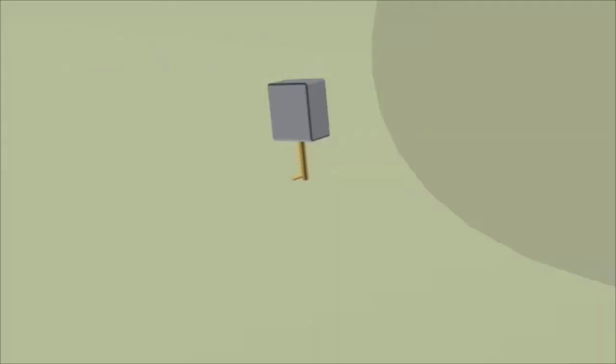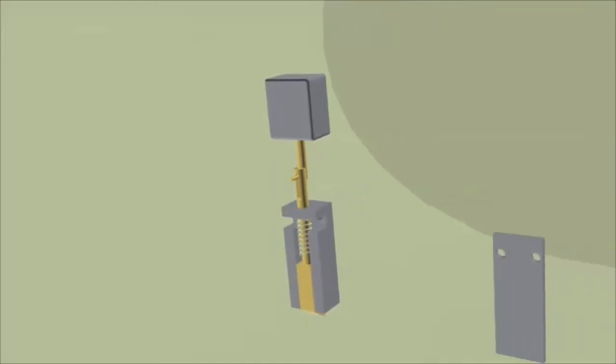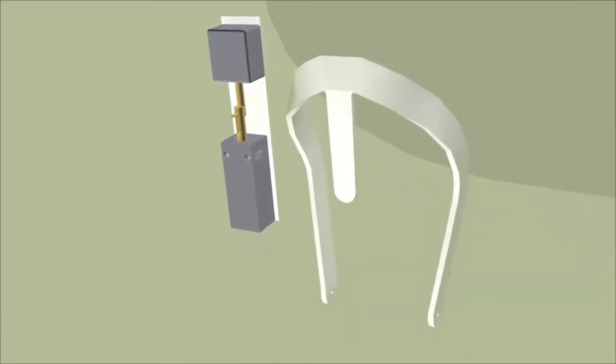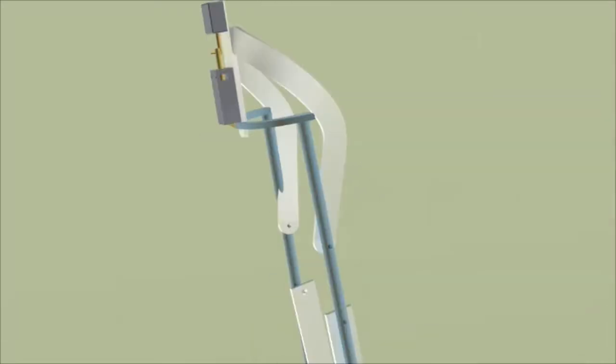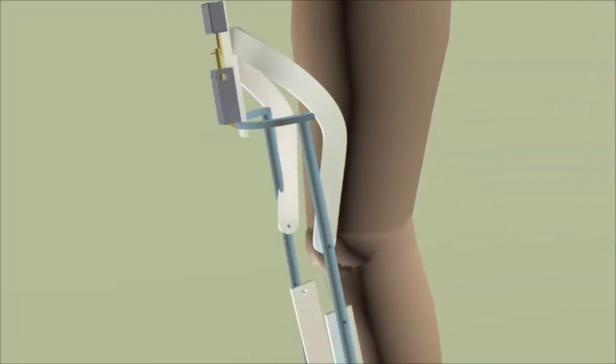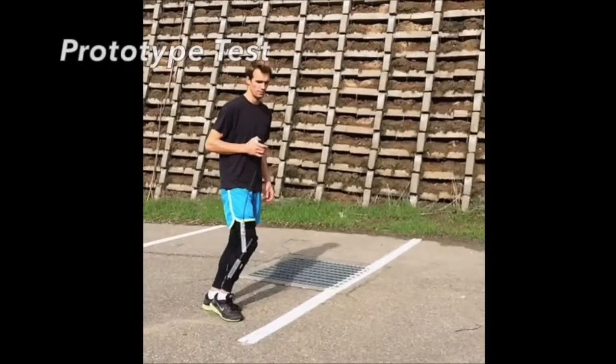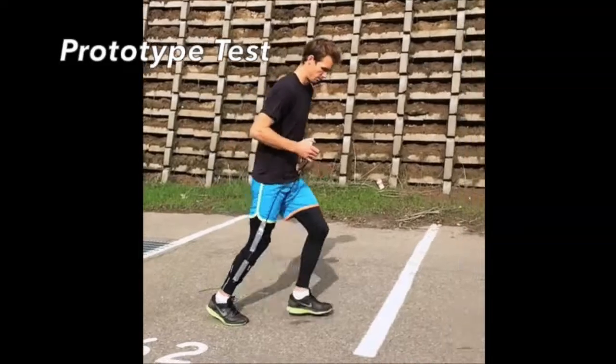Here at Run Free Knee Brace, we are creating an innovative solution for Jack's problem. We have developed an electronically actuated knee brace, which serves to decrease the likelihood of a knee injury, facilitate rehabilitation of current knee injuries, and lower the overall metabolic cost of running. With the help of the Run Free Knee Brace, Jack is back in action!